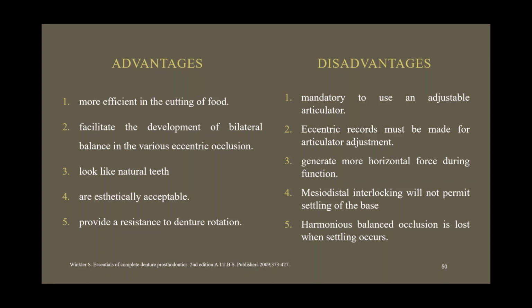While using the anatomic teeth, it is mandatory to use an adjustable articulator, and eccentric records must be made for the balanced occlusion. The cuspal inclinations generate more force during function, and the mesiodistal interlocking will not permit settling of the base.